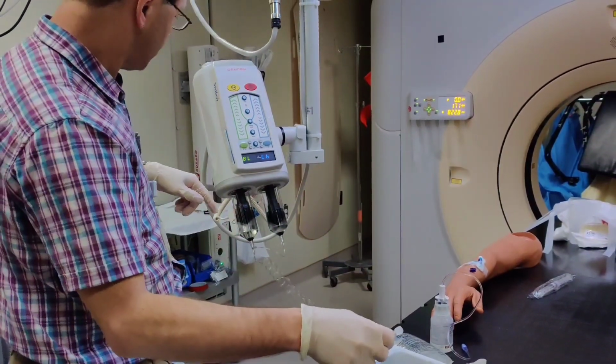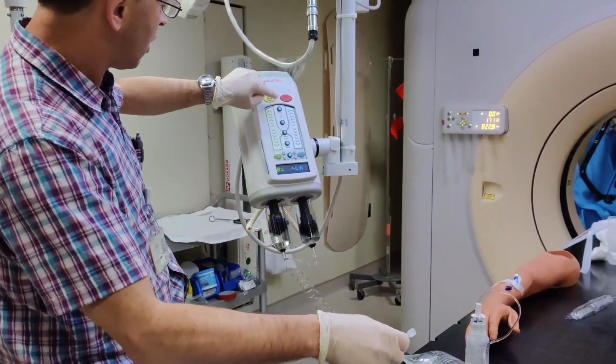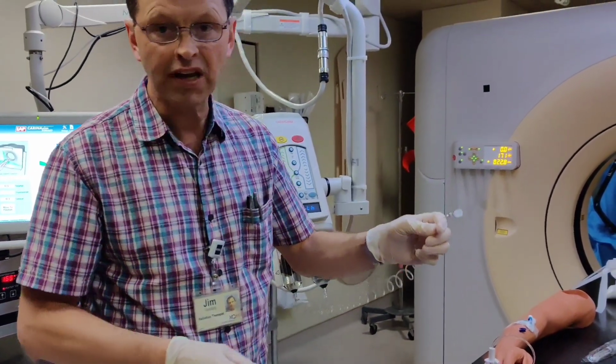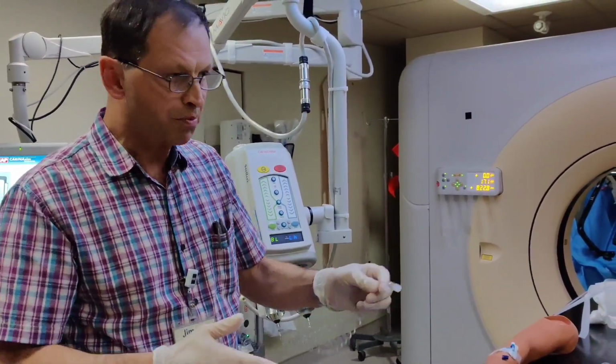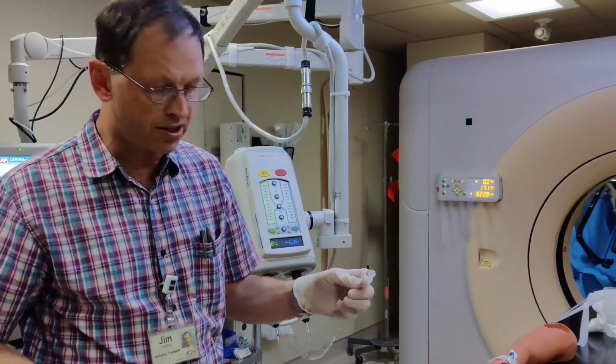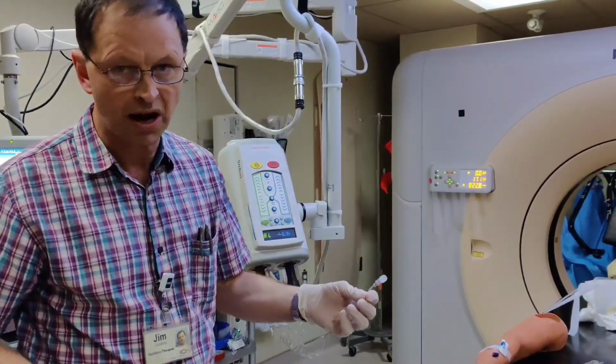So at this point, before we can do the injection, we'll need to make sure that we've armed the system, and we'll also have to confirm that we've removed any air from the system. So at this point we'll take a break, and then we'll go to actually connecting the contrast line to the IV that was put in place by the nurse in RadPro.